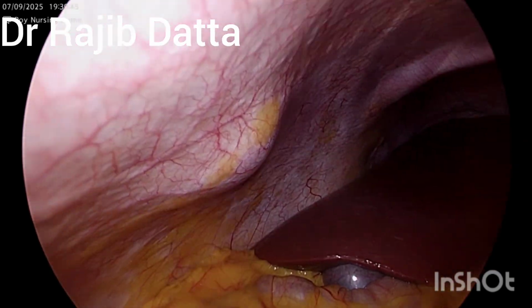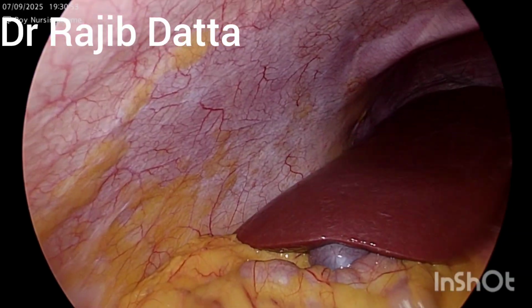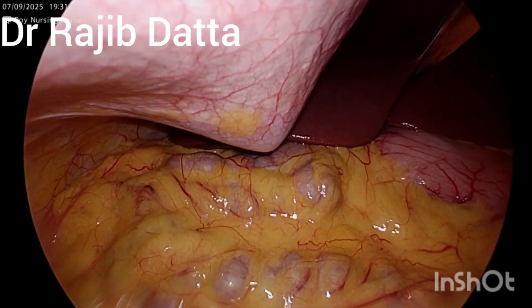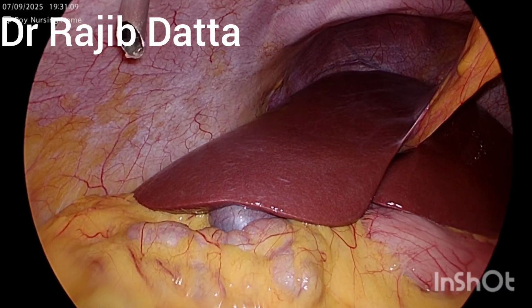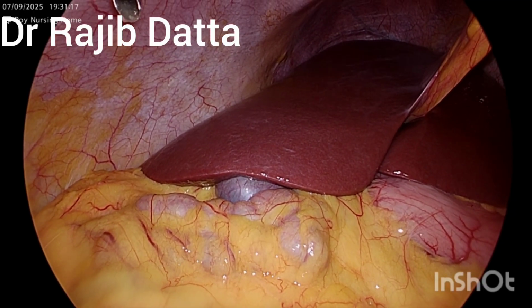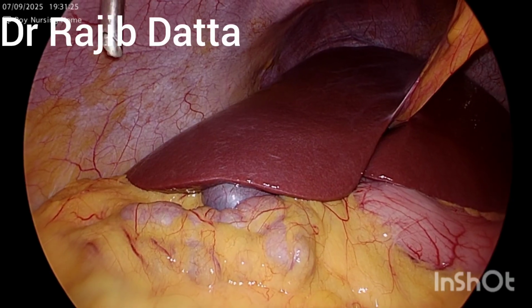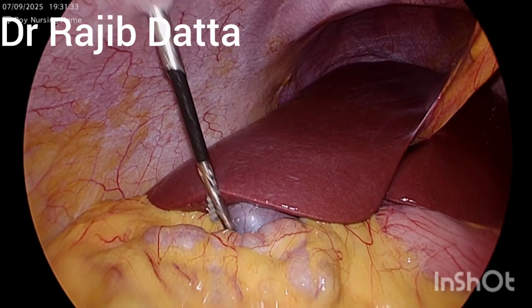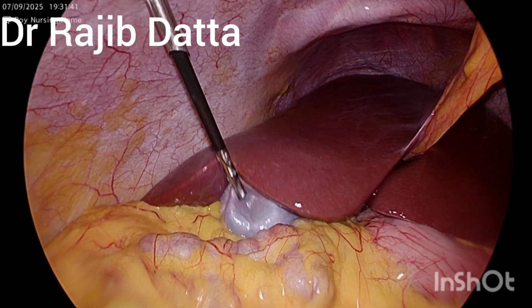The mid clavicular 5 mm port is going to be introduced, and the pressure is remaining 12 mm of Hg, and the flow rate is 9 liter, and the patient is operated under spinal anesthesia with sedation. So our first job is the adhesiolysis, and the fundus of the gallbladder has been grasped.